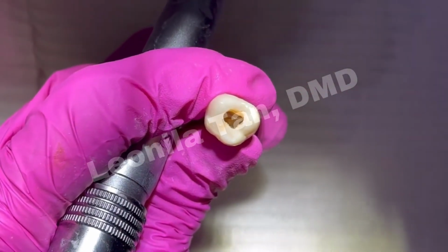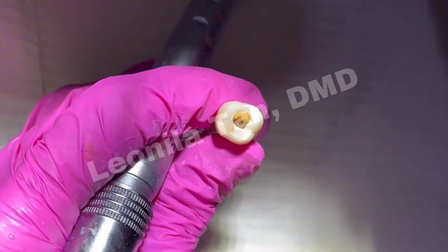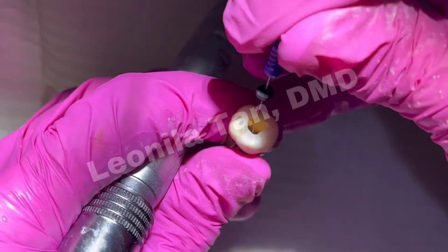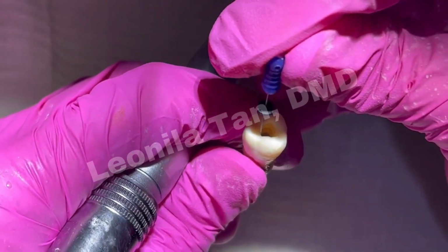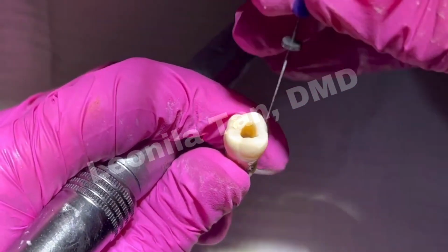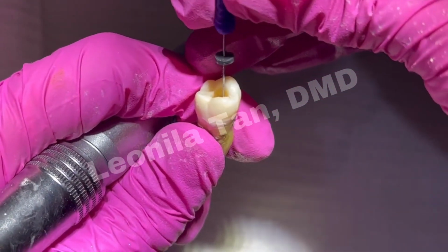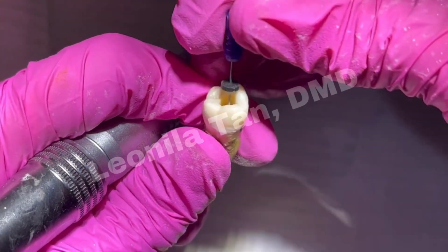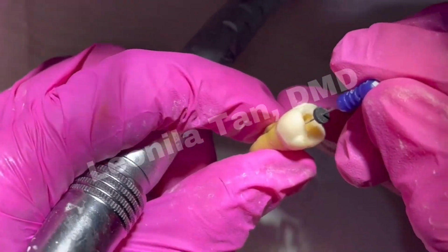And let's check with the files. So a while ago, it would enter on a side. Now you're able now to enter straight on. That's your distal buccal. For the mesial, you're able to enter also straight on. Notice. And also for the palatal.